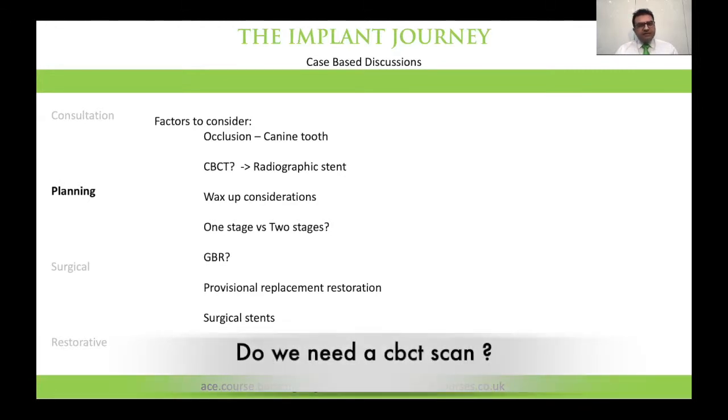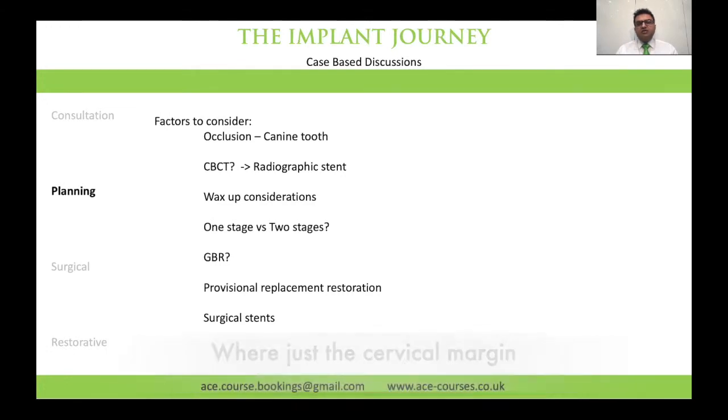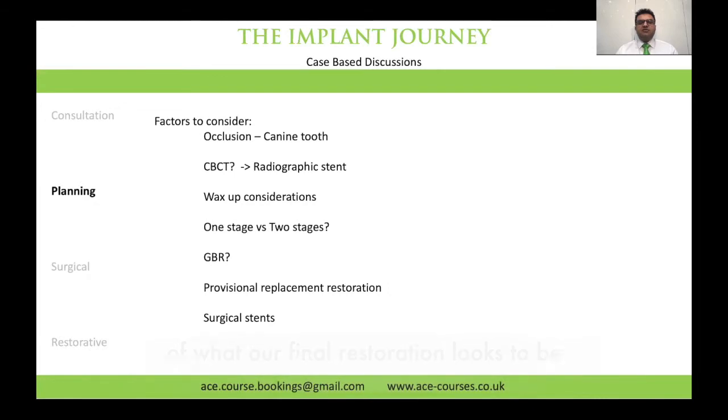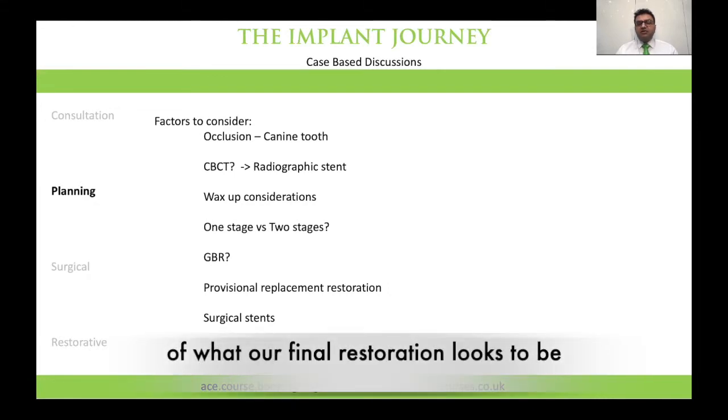Do we need a CBCT scan? Do we do wax-ups? And if we do, use this to then subsequently provide radiographic or surgical stents. What are we looking out for from the wax-ups? Where does the cervical margin of the wax-up finish? And is that exactly the cervical margin of where our final restoration needs to be? Because that will determine the apicocoronal position of the implant placement.